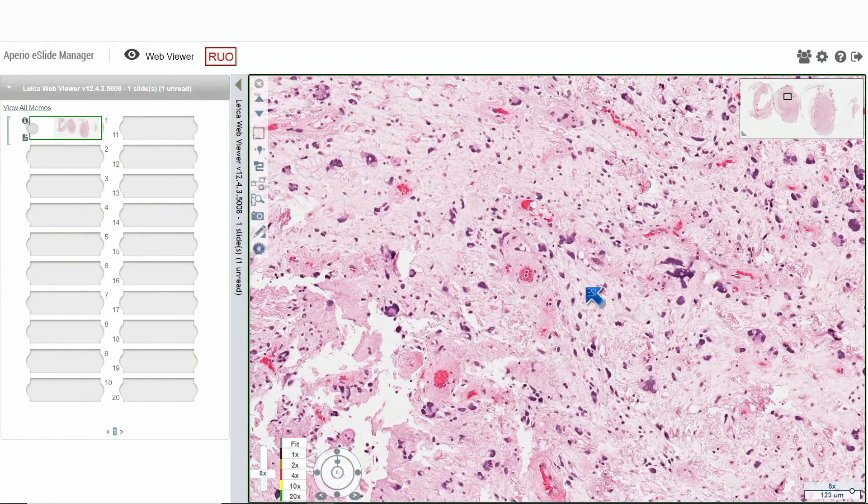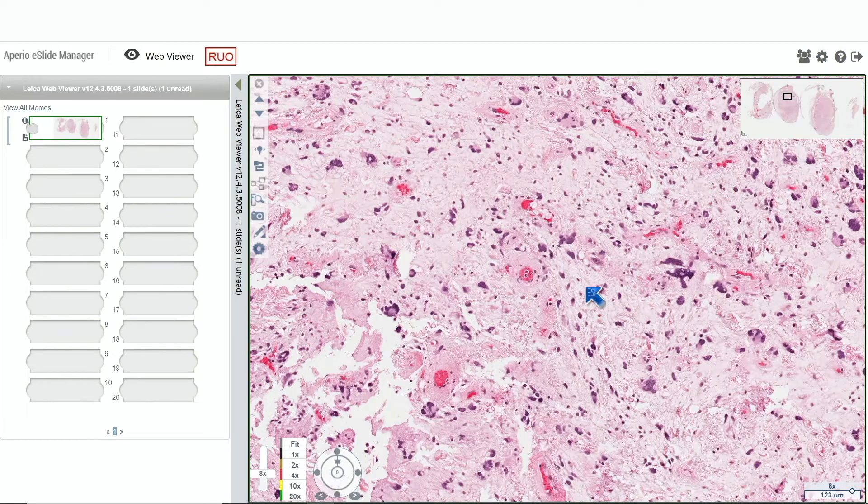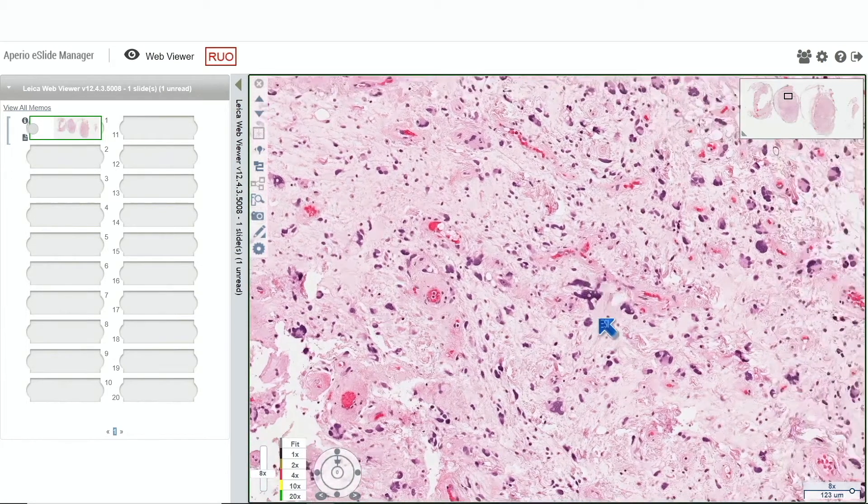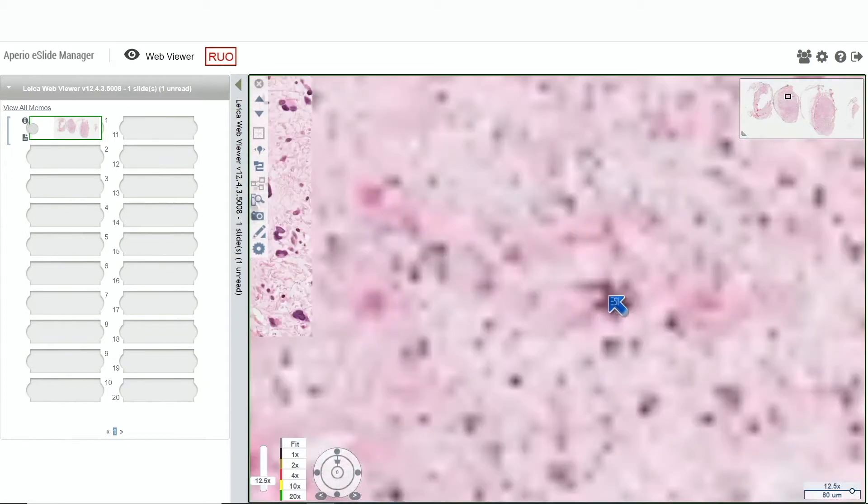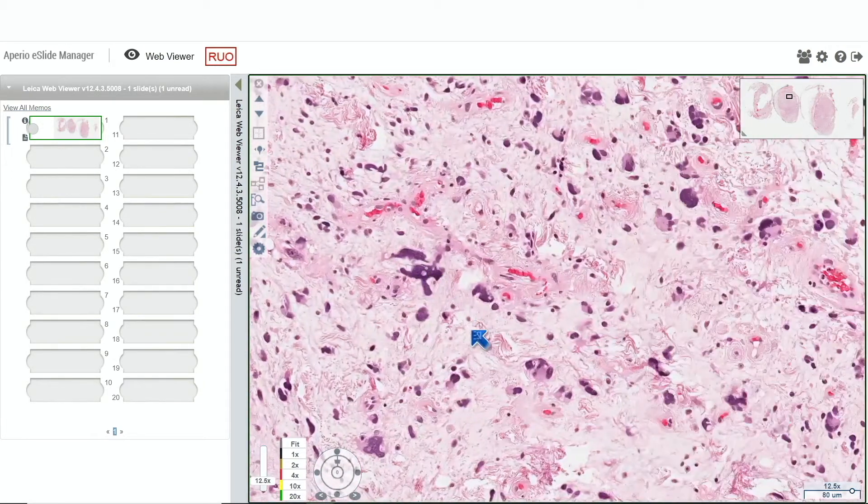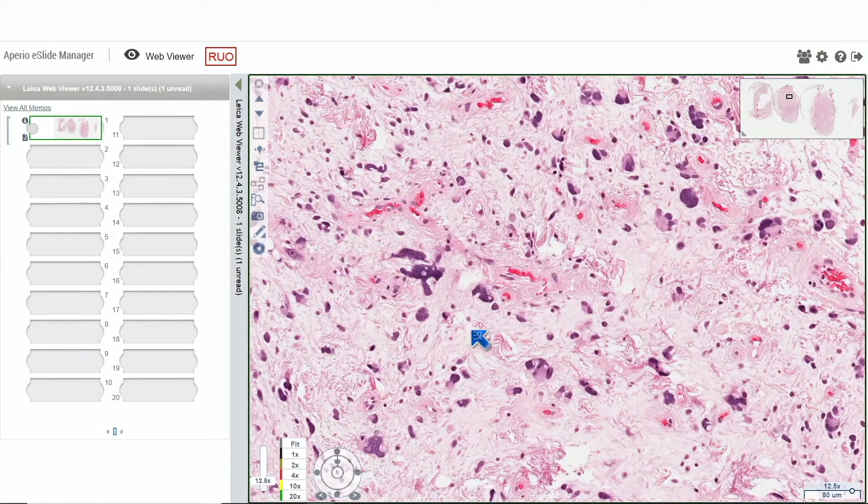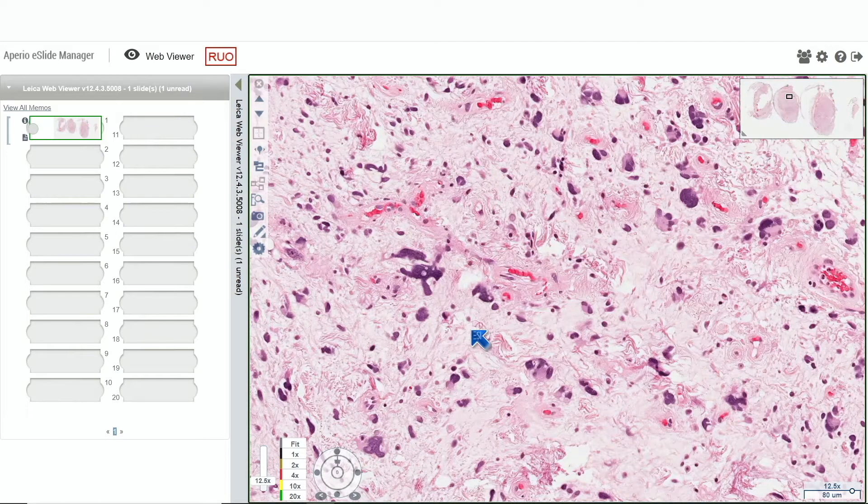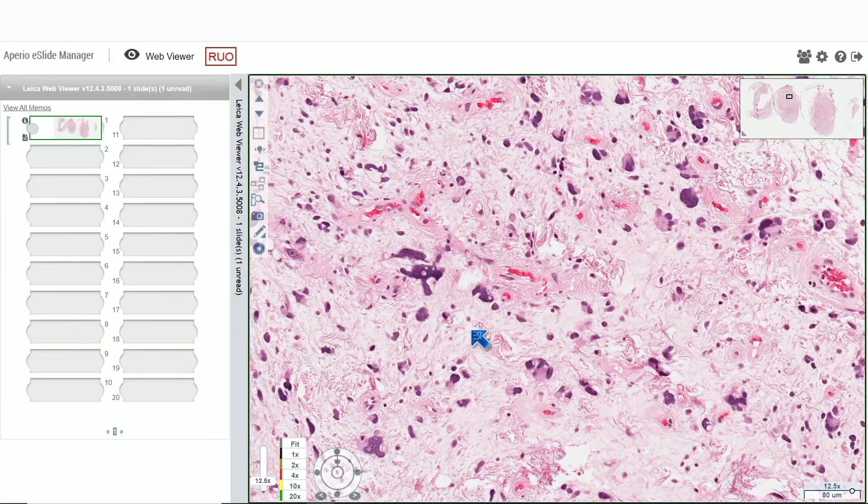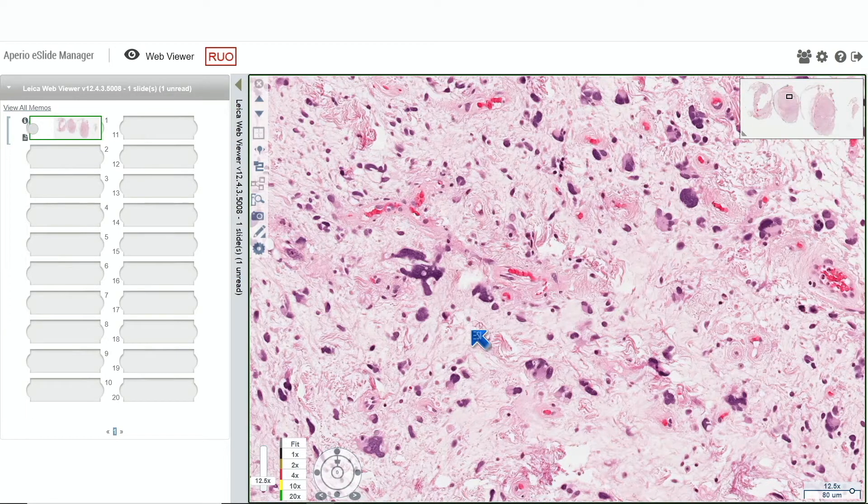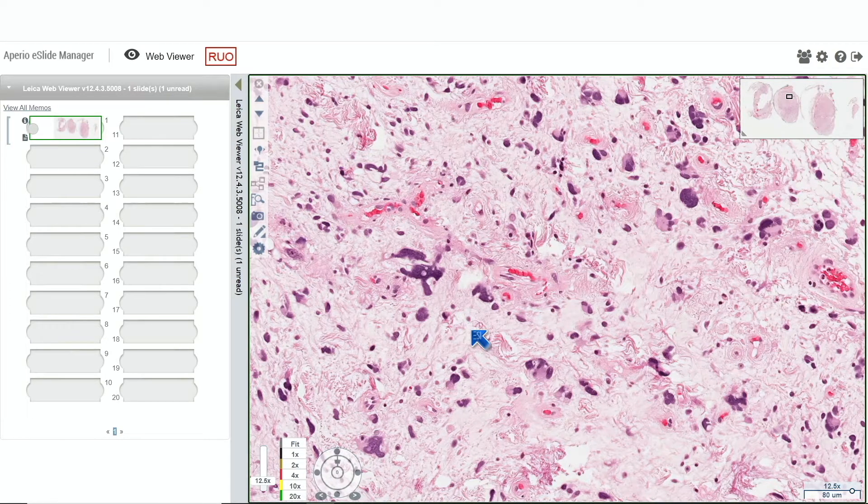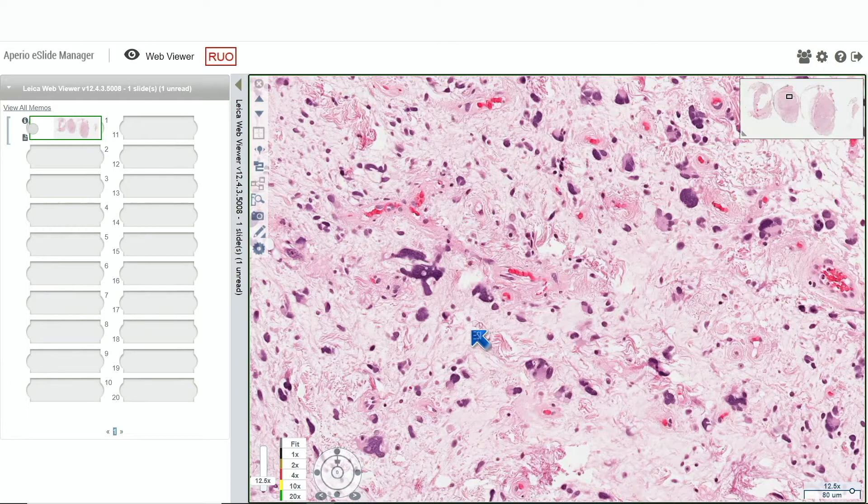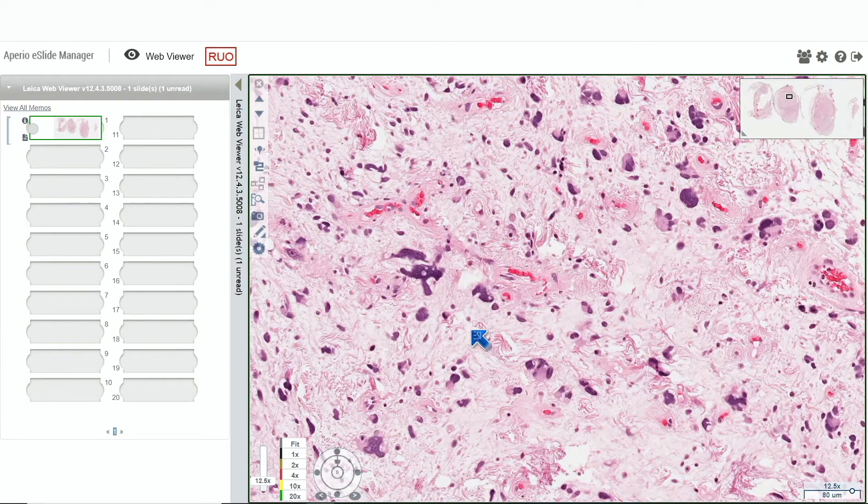Any questions about this? Look how bizarre these cells are. This is pretty scary looking, especially if there's no fat. You start going, "Oh man, is this a myxofibrosarcoma or undifferentiated pleomorphic sarcoma?" I've had cases where the differential diagnosis was pleomorphic lipoma versus an undifferentiated pleomorphic sarcoma, what we used to call MFH.